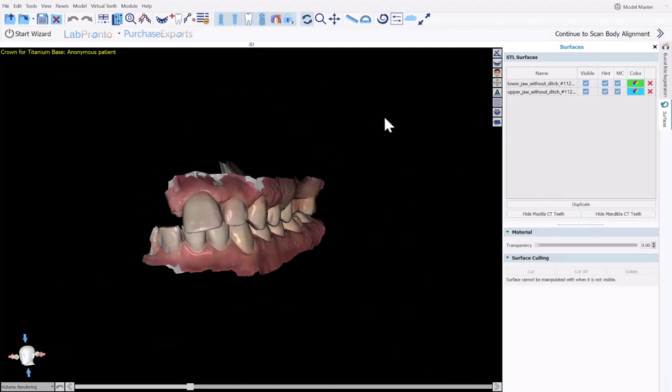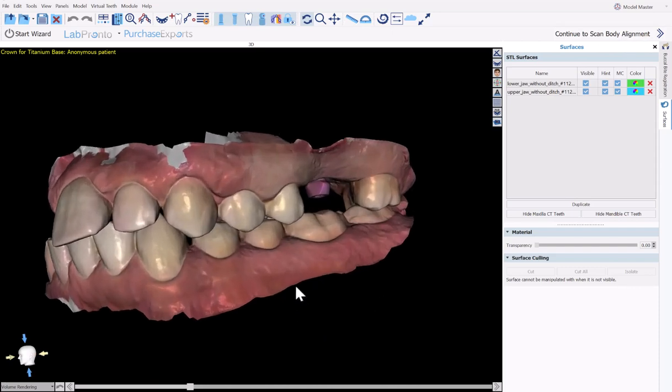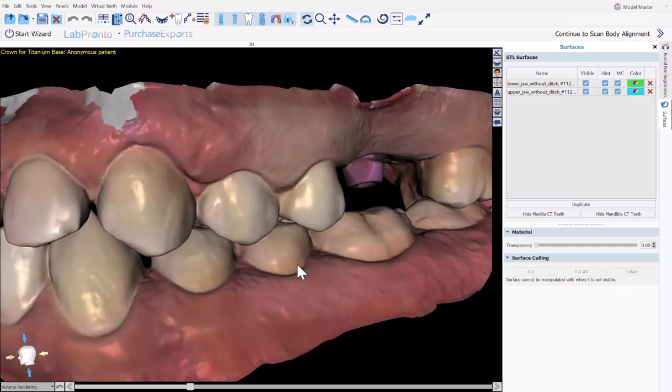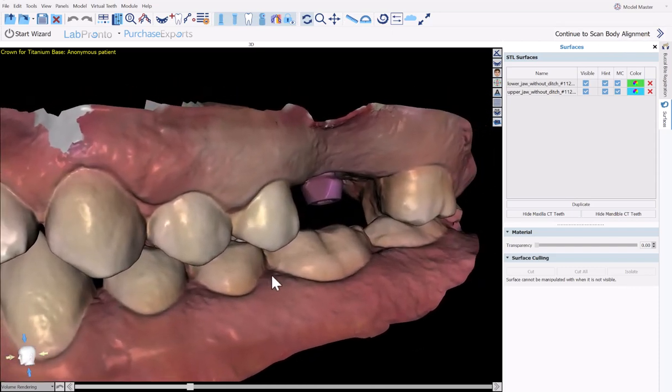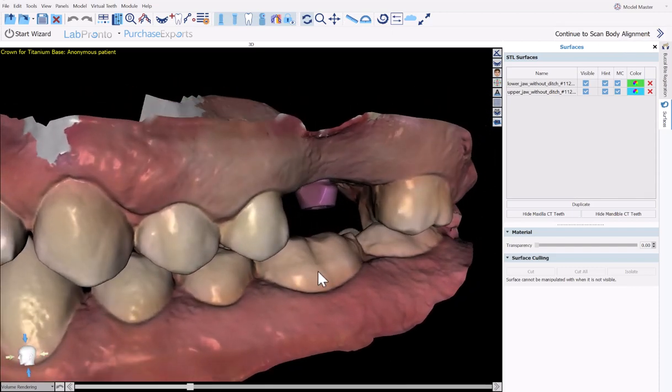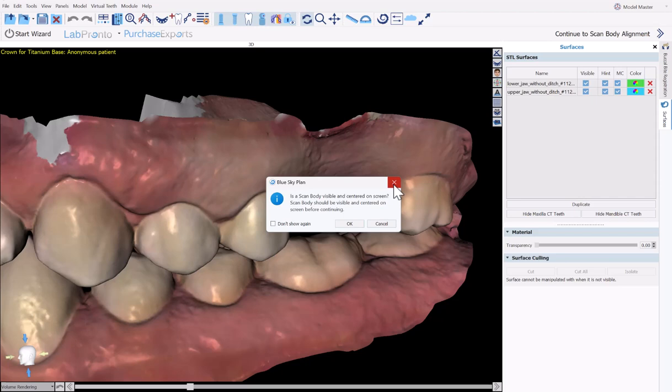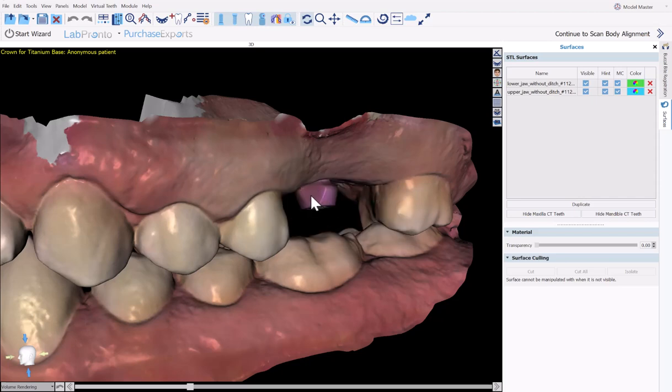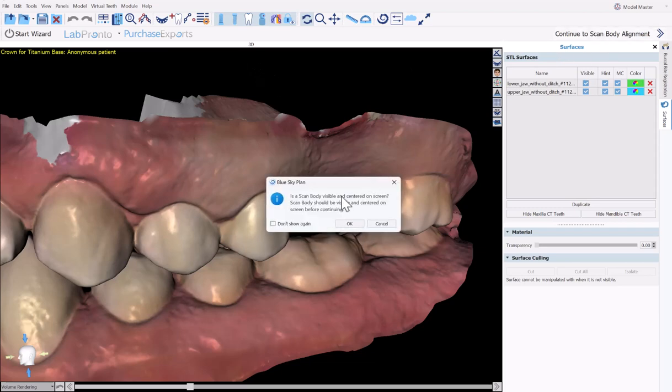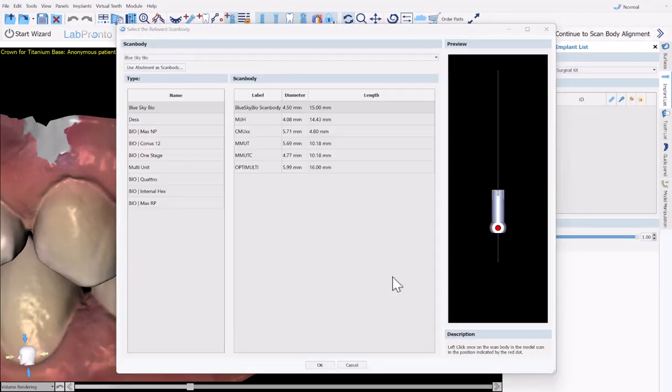We are now prompted with the next step to continue to scan body alignment. Before doing so, make sure to rotate the models and zoom in so that you could clearly see the scan body and the flat surface on the scan body. Then click continue to scan body alignment. The message that comes up on screen is confirming exactly what I just said to make sure that the scan body is visible and centered on the screen.